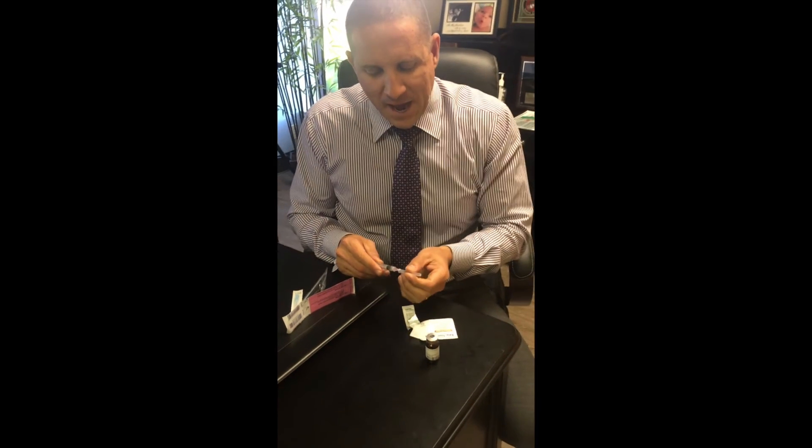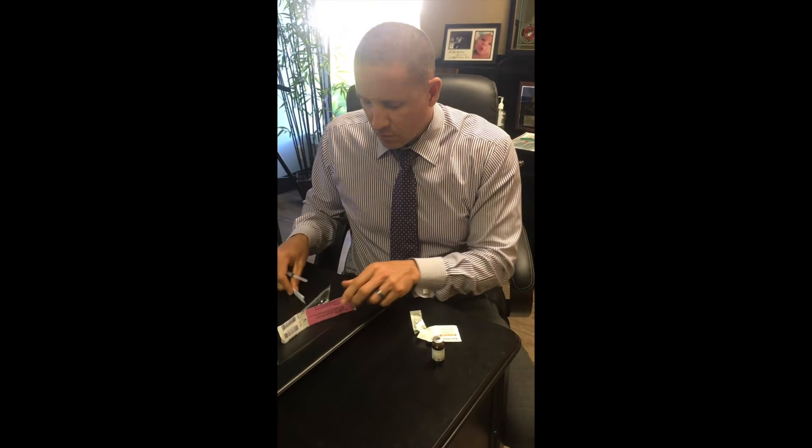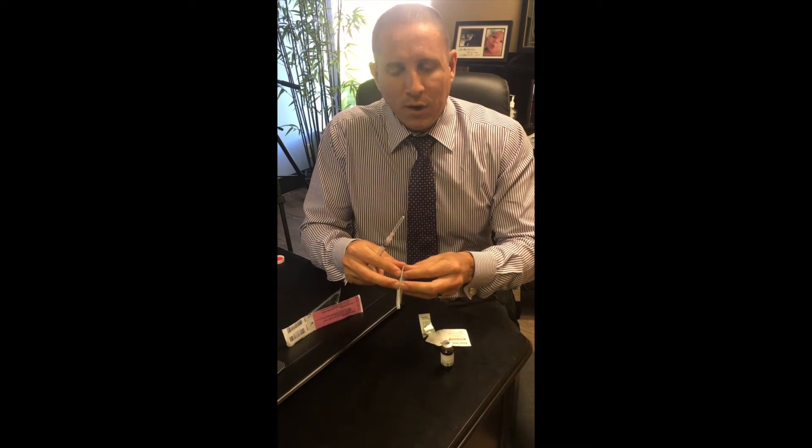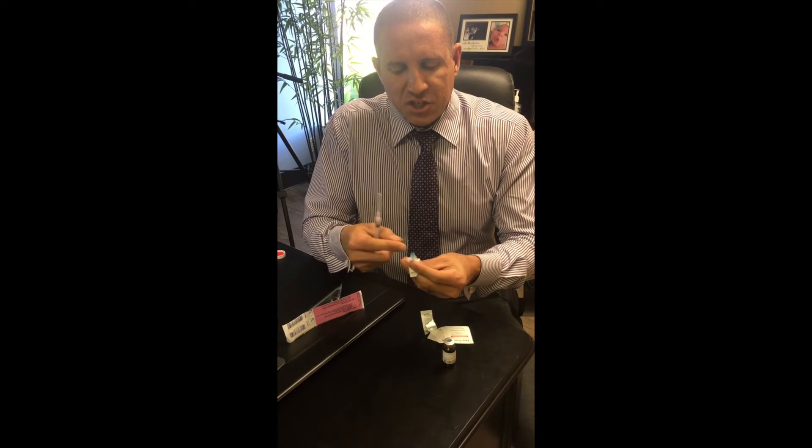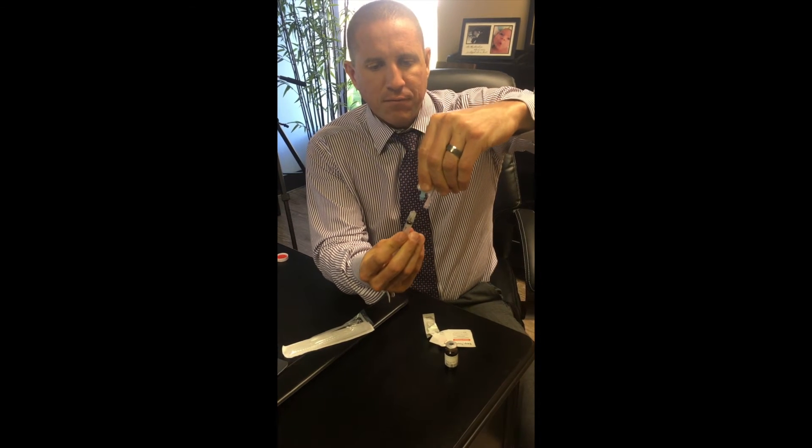Then you're going to take this needle off, recap it, open up your 25 gauge 1 inch needle — again, this is sterile so you don't want to touch the top. Screw the old one off and screw this one on, and now you're ready to inject.